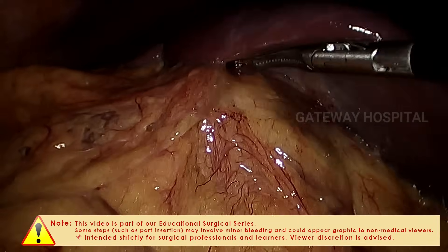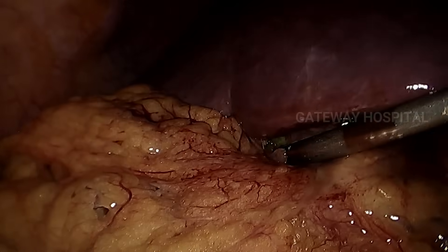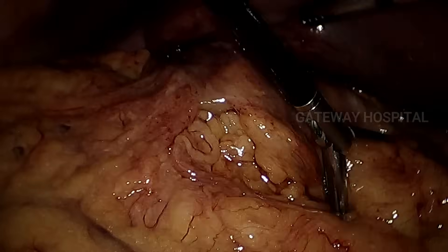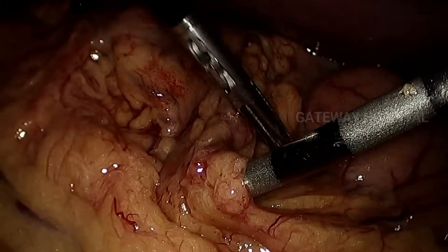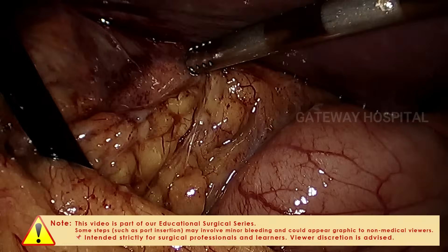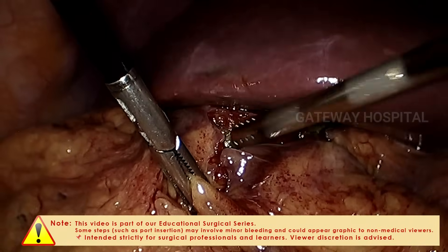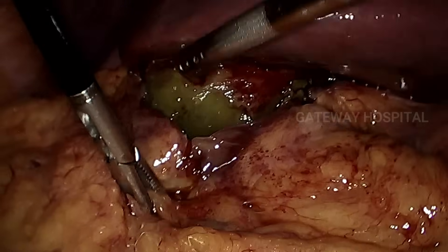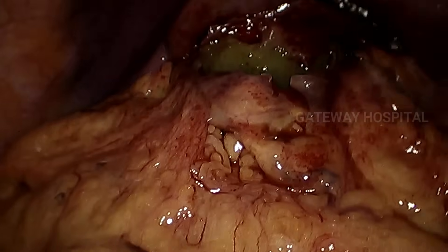So if you are not able to see the gallbladder, always trace the liver surface and from there you have to go towards the gallbladder wall. If you try to go into the mass covering the gallbladder, there is a chance of injuring the duodenum or colon, so you have to be very careful — always identify the gallbladder wall and work on the gallbladder wall. That is the trick while managing any difficult gallbladder.